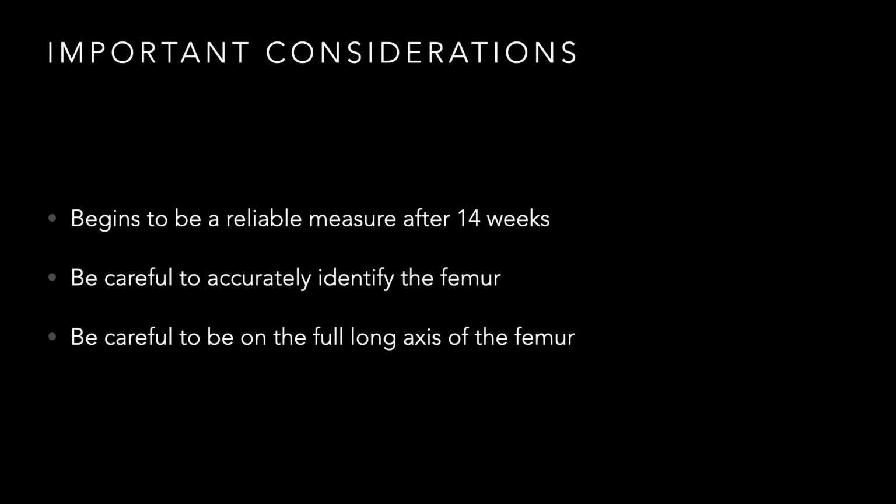But generally, at the end of the first trimester, into the early parts of the second trimester, this tends to be a decently accurate measurement metric. And like I said, with that one study I mentioned before, combined with the head circumference, it tends to be a very accurate way of estimating gestational age.